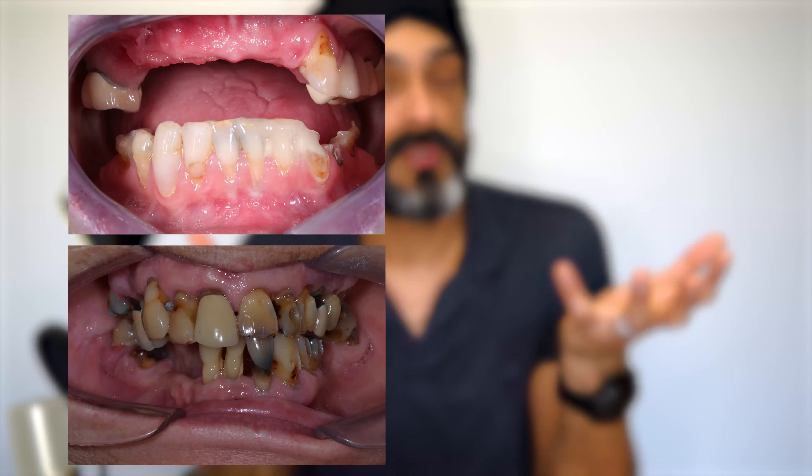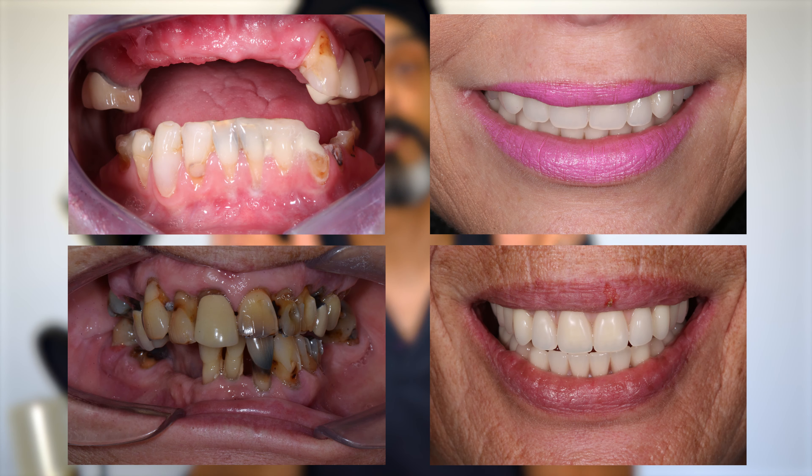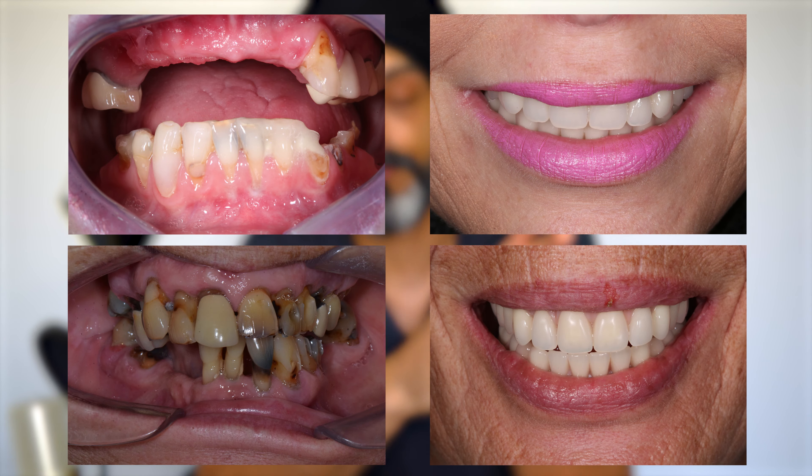My name's Gers, I'm a cosmetic and implant dentist based near London in the UK. And if you've been following this channel, you probably realise that we do quite a lot of All on 4 treatments. All on 4 treatment is really where you've got a set of really bad teeth, we remove all of the teeth, we place our implants where we can, and we fit at least really good temporary teeth on the day of the treatment. So it's quite a lot of stuff to do, and it's all done typically in one day.